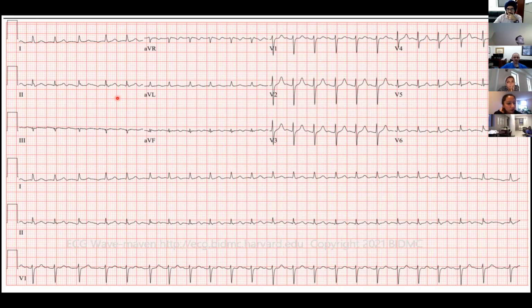Another question is: are you dealing with organized or disorganized activity in the atrium? I would say disorganized. I think you started off really nicely. You were thinking about a P wave, but then you're also not as sold on it, oh, this is just AFib. This one is a little bit tricky, and it needs a little bit of training of your eye. If you look at lead 2, you have this, then you have something buried here, then you have this, and all these deflections are kind of connected by this slurred line.